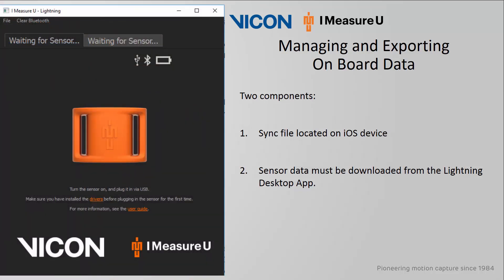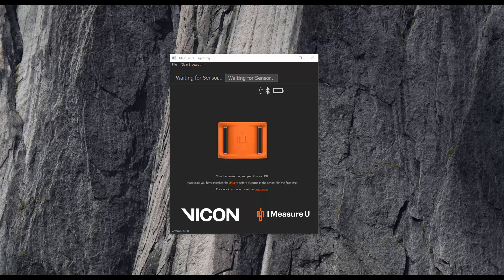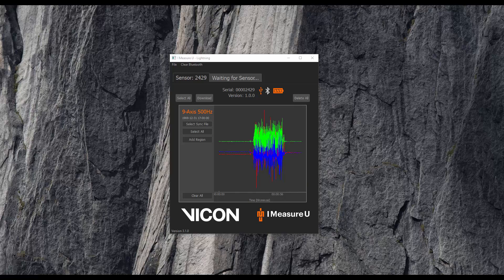The second component requires the data from the sensor to be downloaded using the Lightning desktop app. This app can be obtained from the Downloads page on the Vicon website. Please ensure your computer meets the minimum requirements and that you download and install the necessary drivers for communication with the sensors. The Lightning desktop app can support up to two sensors at a single time. Before plugging in a sensor to your computer using the micro USB cable, make sure that it has been turned on. When plugged in, the sensors will populate automatically in this app.